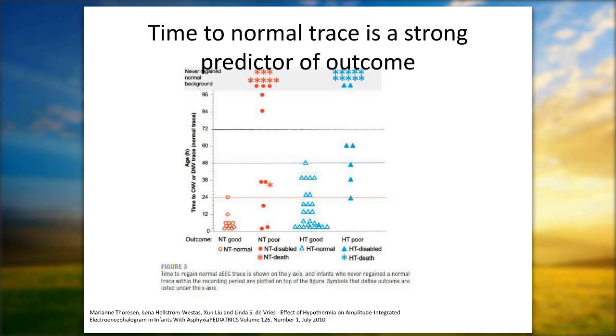And I think that's great, you guys are using EEG as well. I think that these new devices that can do both full EEG with access for our neurologists, and aEEG trending for the bedside staff are really the best of both worlds. As happens in the States, usually when we have full continuous EEG, it's only continuously recording. It's not being continuously reviewed.